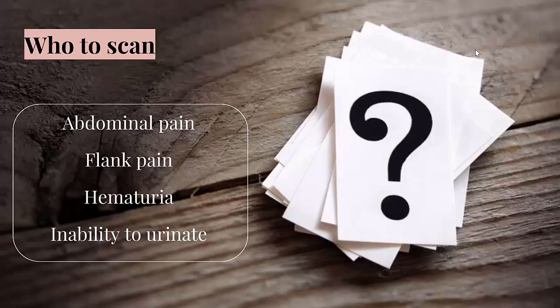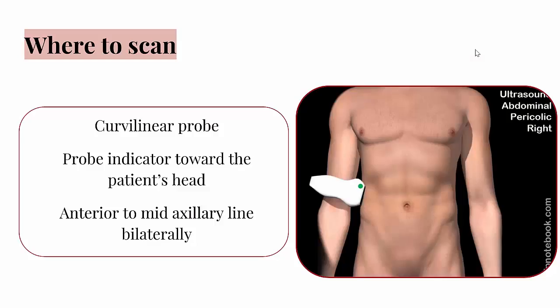Additionally, renal ultrasound is going to be useful in patients who present complaining of an inability to void and possible urinary retention. Ultrasound can also be used to check the volume of the bladder and look for hydroureter. Additionally, in patients with flank pain or back pain, it is good practice to take a quick scan of the aorta and look for abdominal aortic aneurysm. All of this can be completed at the bedside in a few minutes.